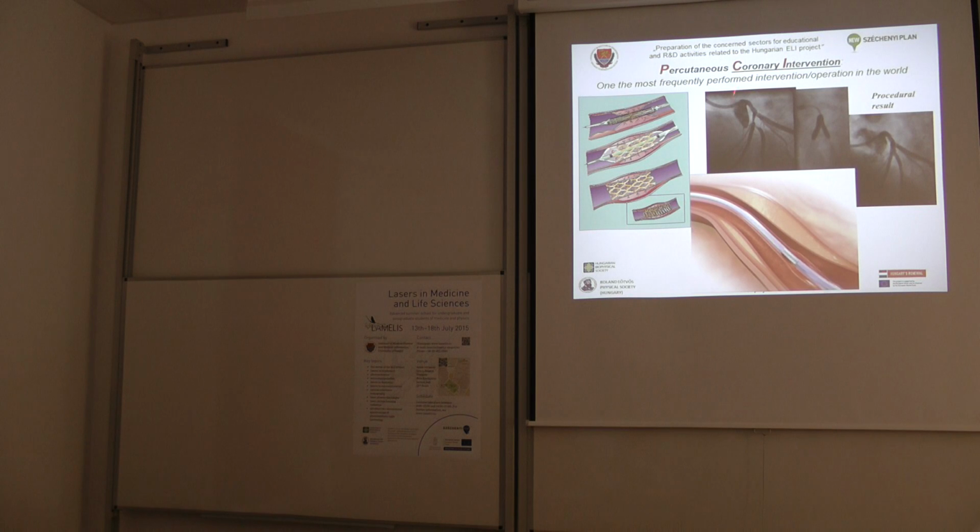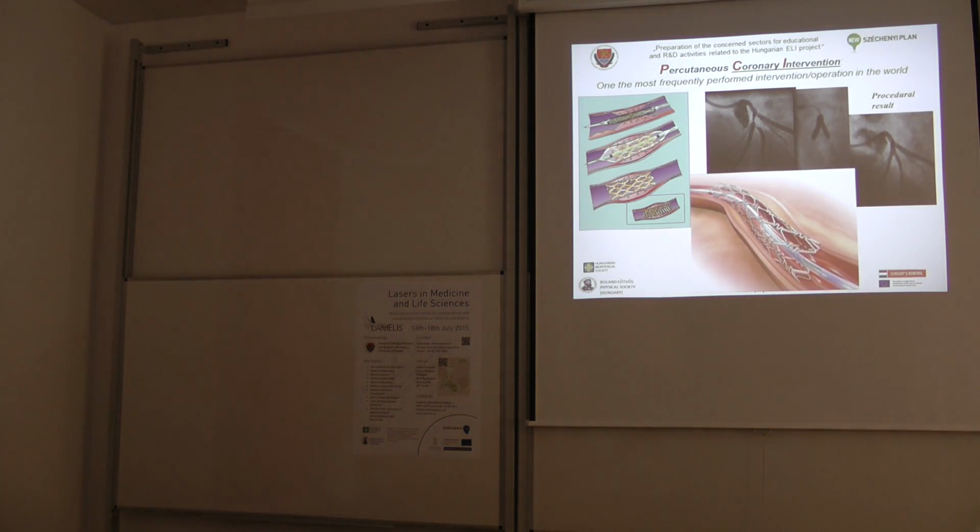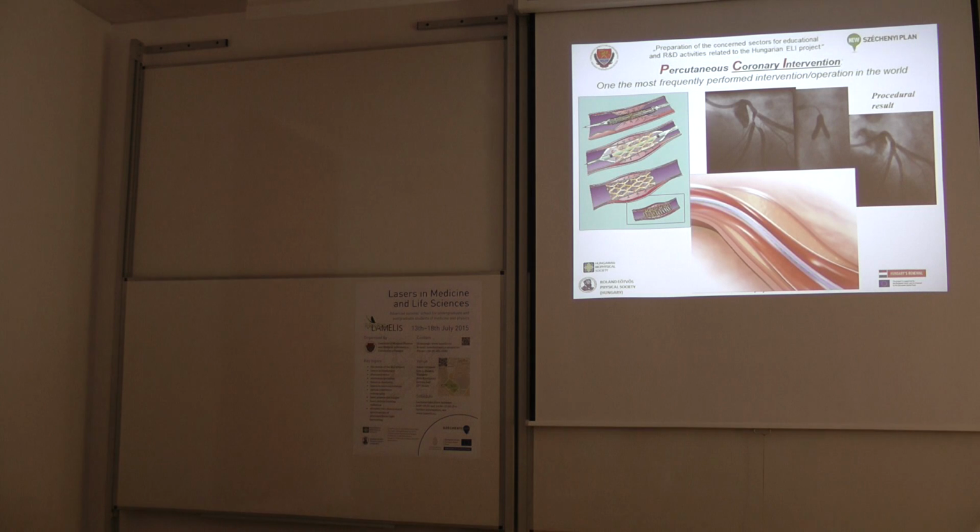at least its lumen, filled with contrast dye by means of a catheter, and this will reveal those alterations, those obstructions, those stenoses, as we call them, inside the coronary arteries, which are responsible for the patient's illness or acute illness.